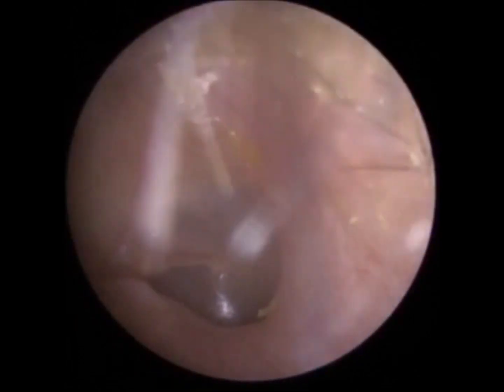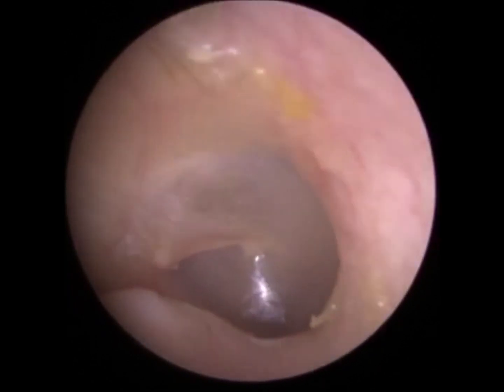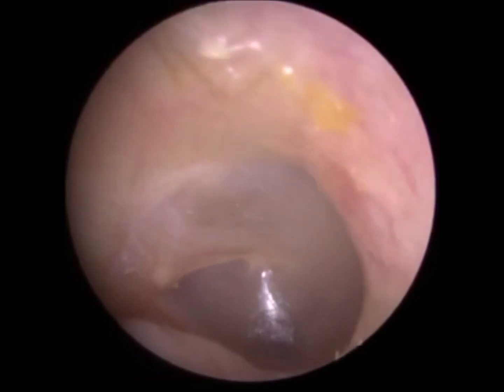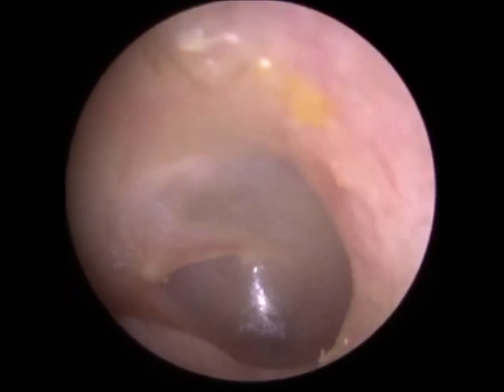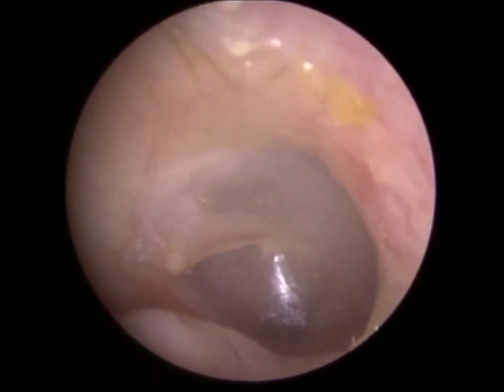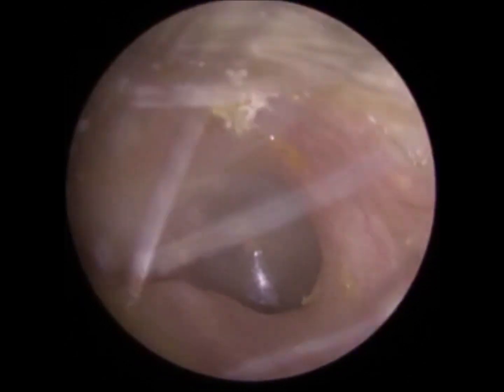So in both ears you've got protrusion of the bony part of the ear canal — the front part. I thought it was swelling, but the fact that you've got it in both ears, I think it's just your anatomical ear really. You've got this bony protrusion — I'll show you on the camera. Wax can get stuck behind that unfortunately. But the ears are nice and clear.